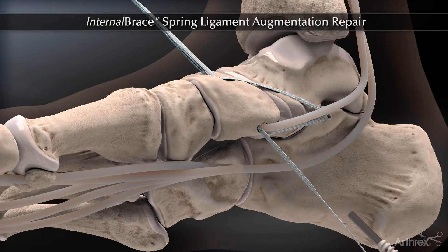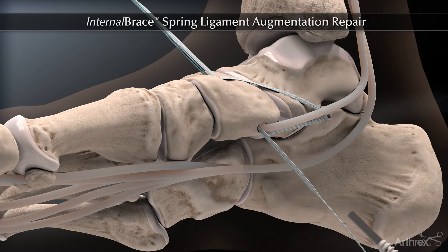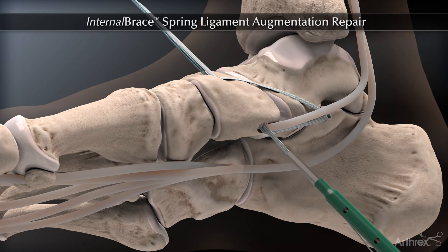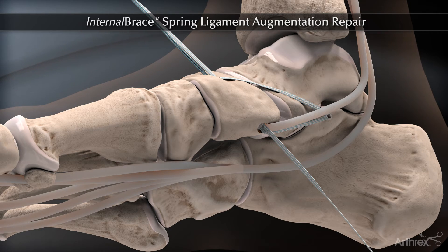A surgical assistant will hold one limb of the fiber tape under tension from dorsal to plantar, and the second limb of the fiber tape — in conjunction with the FDL if transferring — under tension from plantar to dorsal, while the surgeon inserts a 4.75 mm swivel lock. This swivel lock is being used as an interference screw, and the eyelet may be removed in order to obtain fixation.